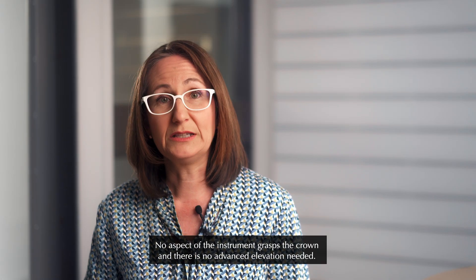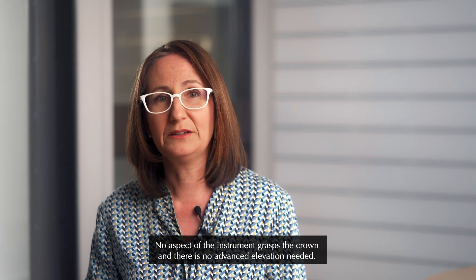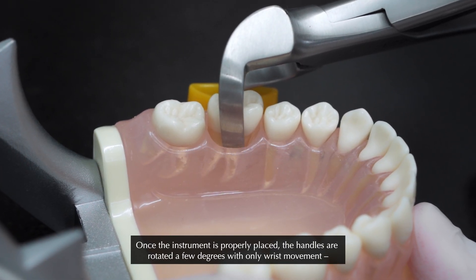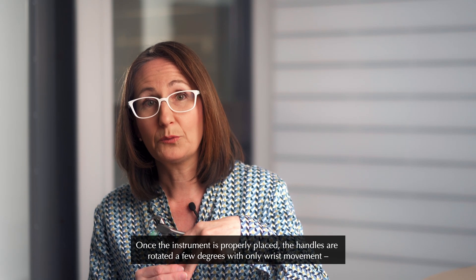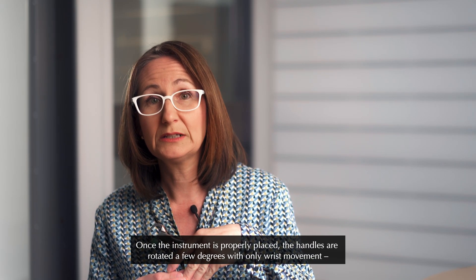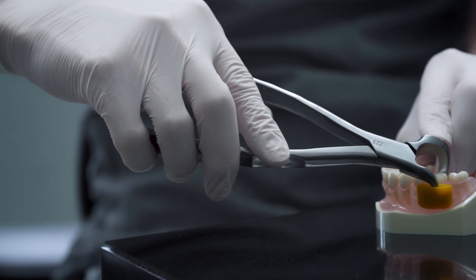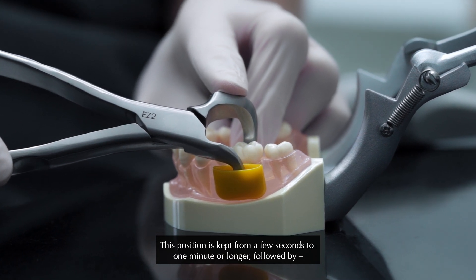No aspect of the instrument grasps the crown and there is no advanced elevation needed. Once the instrument is properly placed, the handles are rotated a few degrees with only wrist movement in a slow, steady and controlled manner.